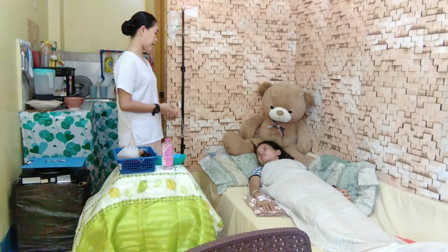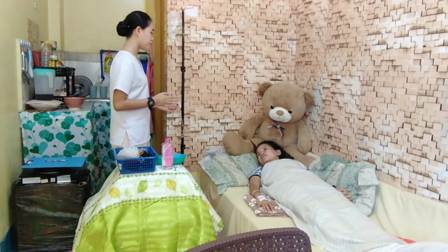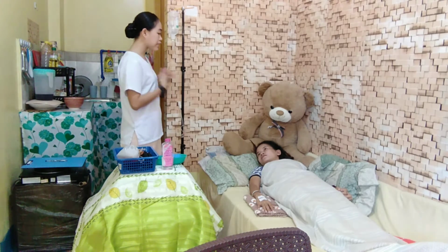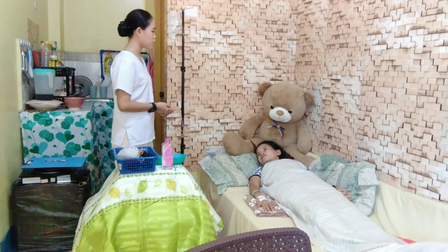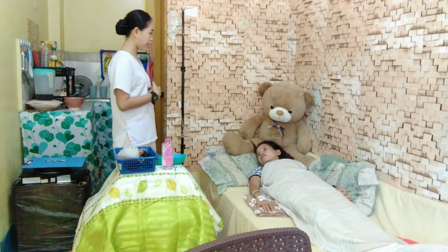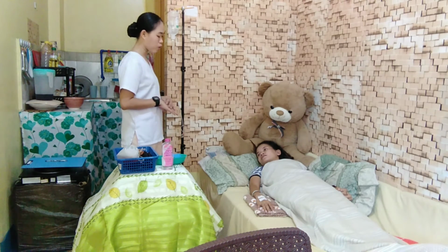This procedure might take about 4 hours, and I encourage you to inform me if you feel any discomfort, pain, or swelling.